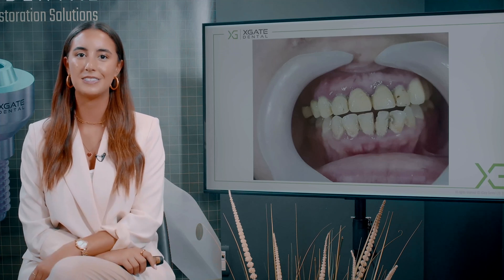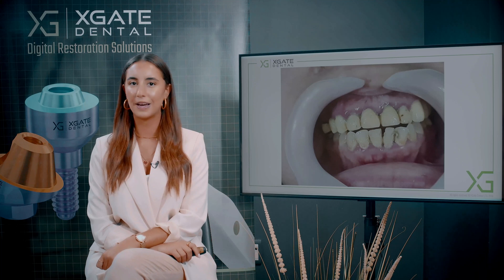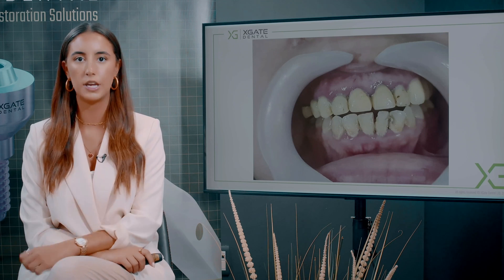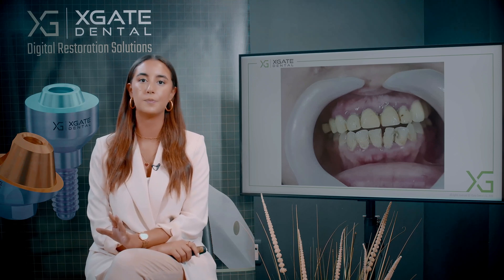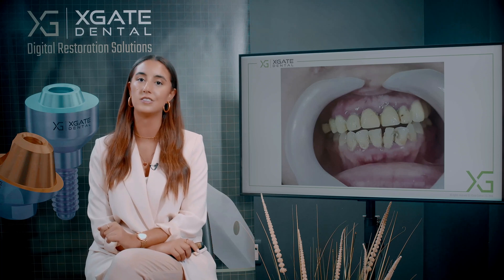You can see the pigmentation and you can see that the periodontal health of those teeth is not the best. We took some x-rays and we'll check the implant and check the teeth. The teeth need to be extracted and they're pretty much hopeless. You can't do anything really good for those teeth.